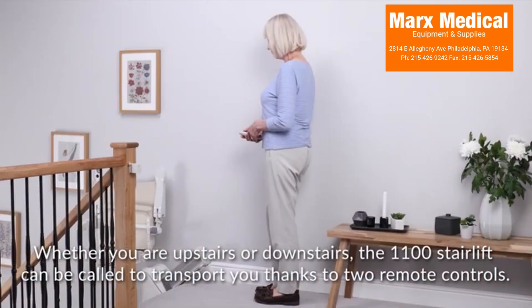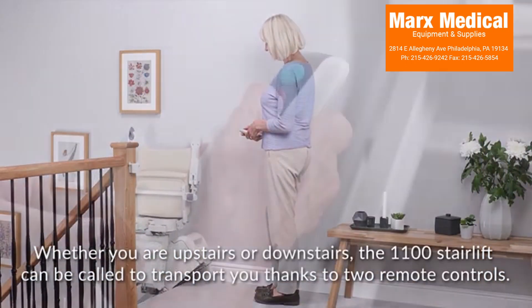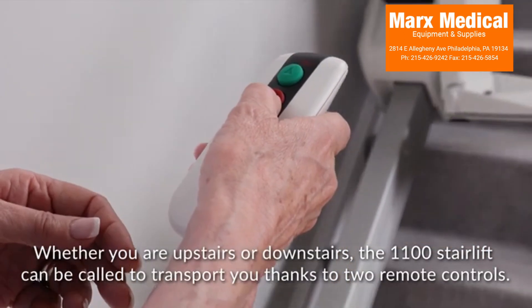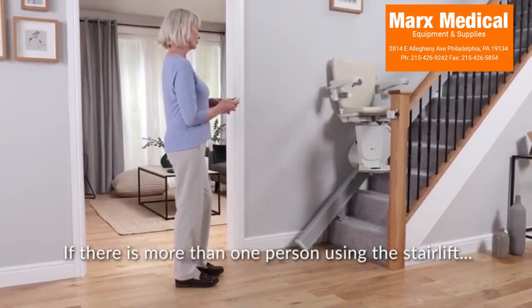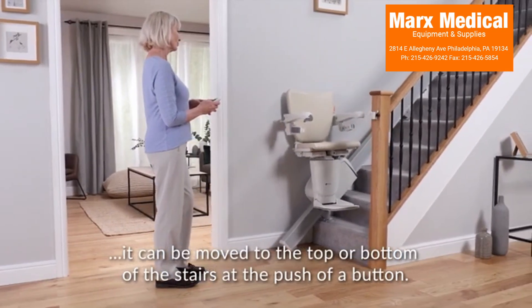Whether you are upstairs or downstairs, the 1100 stair lift can be called to transport you thanks to two remote controls. If there is more than one person using the stair lift, it can be moved to the top or bottom of the stairs at the push of a button.